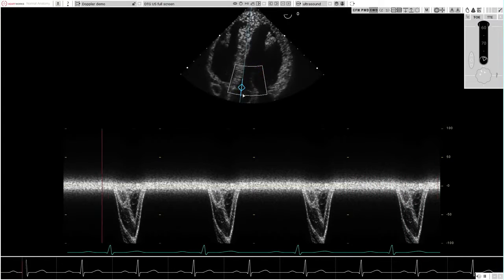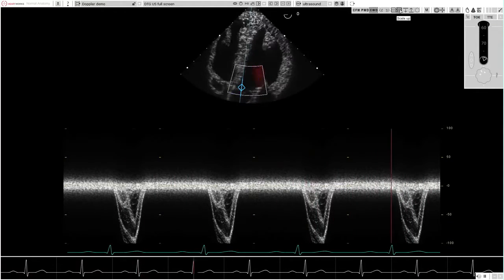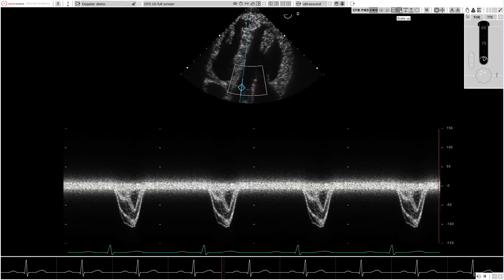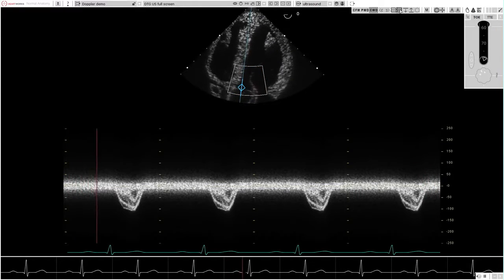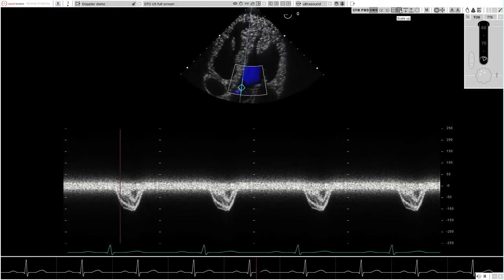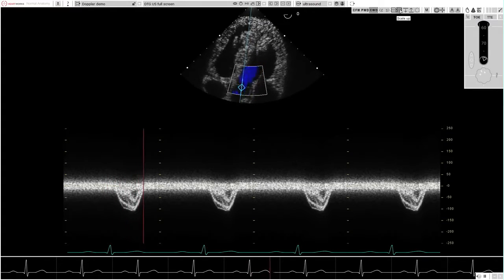Currently, Doppler data has been applied to the normal heart model. It is planned that in the near future, accurate data will be inserted into existing HeartWorks pathological heart models and will be integral to all future pathology releases.